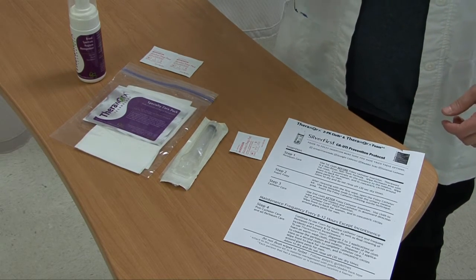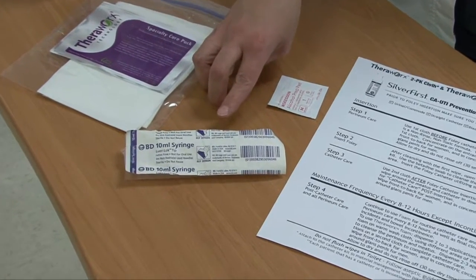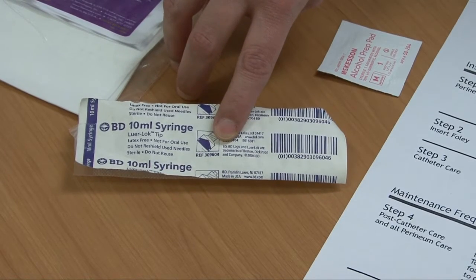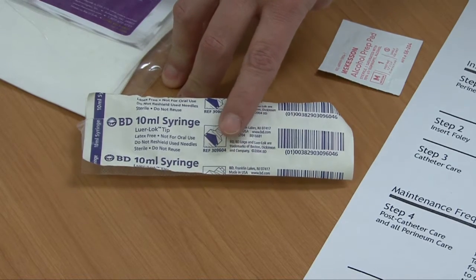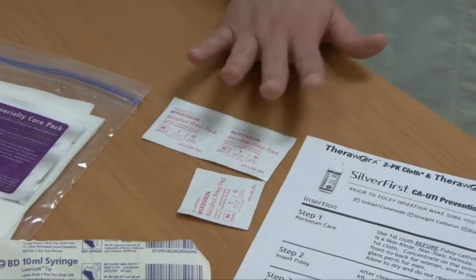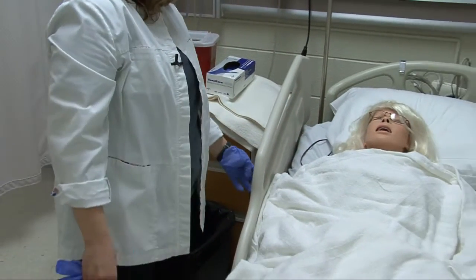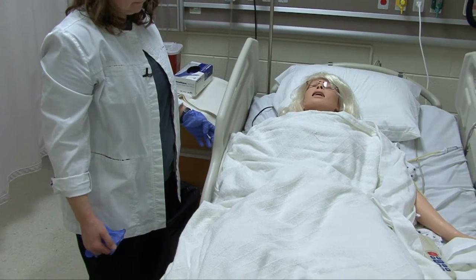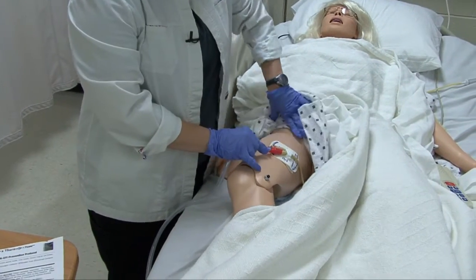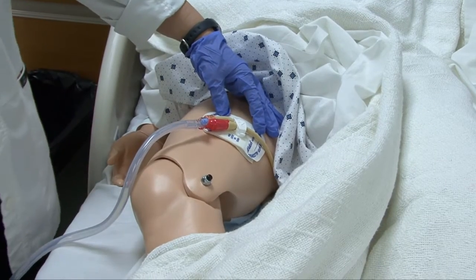Once I've done the cleaning and perineal care, the other equipment I need is a needleless syringe — whatever size fits the catheter. Ms. Smith has a 16 French catheter that was inflated with a 10 milliliter syringe. If you didn't know, you look at the balloon port to confirm. I've also got alcohol prep pads because I need to remove the securement device. Now back in the room, I put on a clean pair of gloves. I raise the bed to my height and uncover enough to reach the catheter.